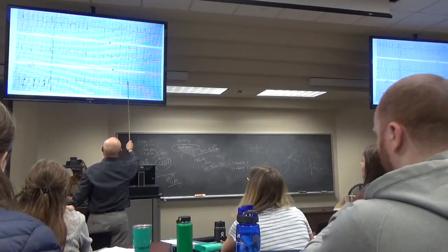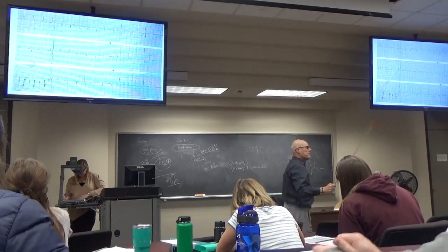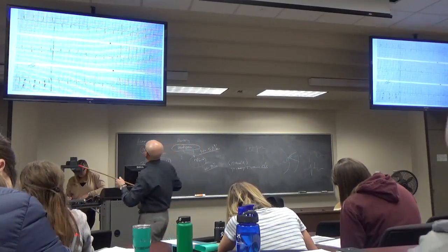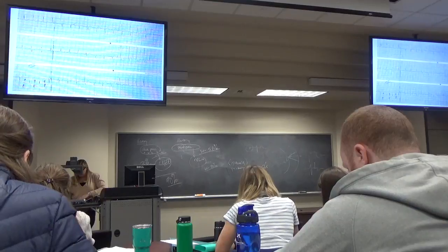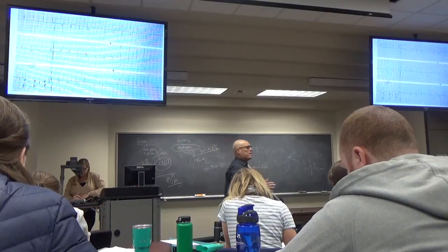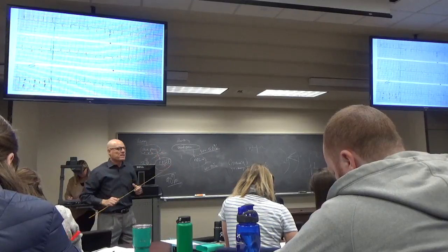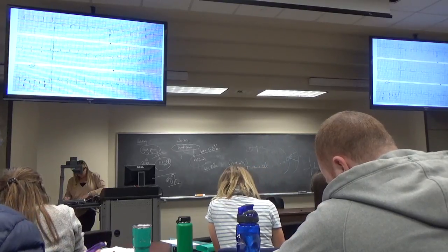What is this pattern of this ST? Strain. Strain pattern? If the patient's not on DIG, that's strain pattern. How many points do you get? 3. You've got LVH. Look at lead V1. In lead V1, can you see the P wave? Yes. Yeah, look at 0.28. It's way out there. The P wave in lead V1 is inverted. It's the biphasic or inverted P wave in V1. That's left atrial enlargement, and you get another 3 points. You've got 9 already. Oh my goodness. So this is left ventricular hypertrophy as determined by an electrocardiogram.